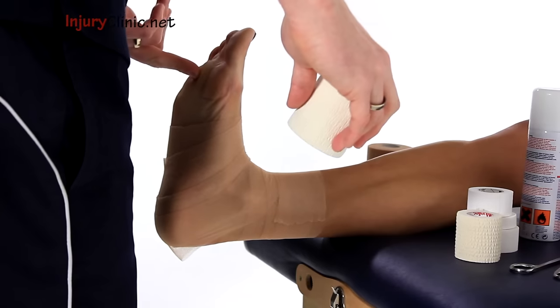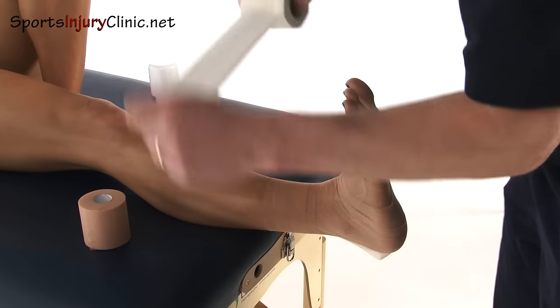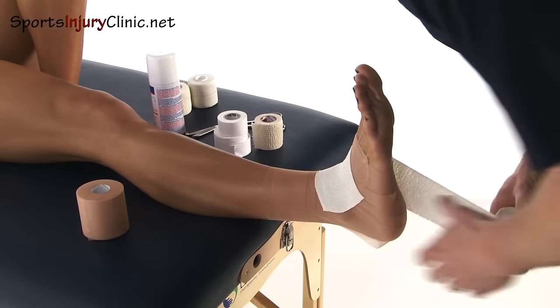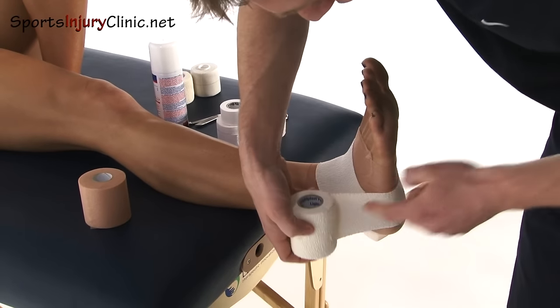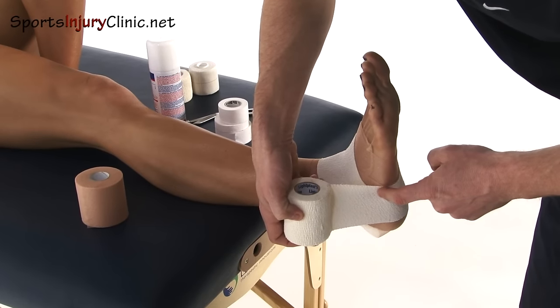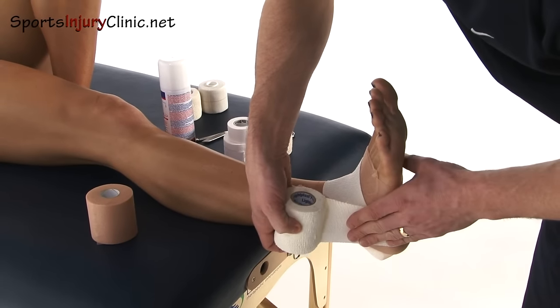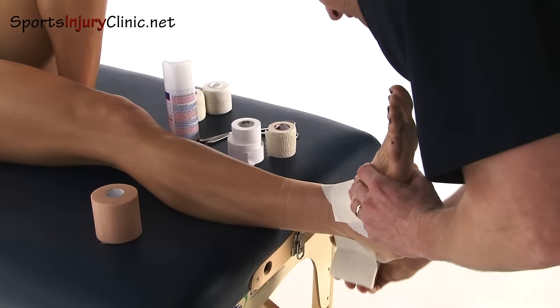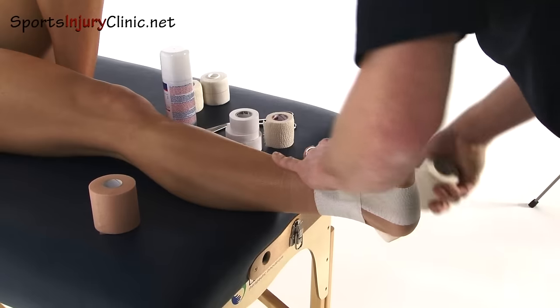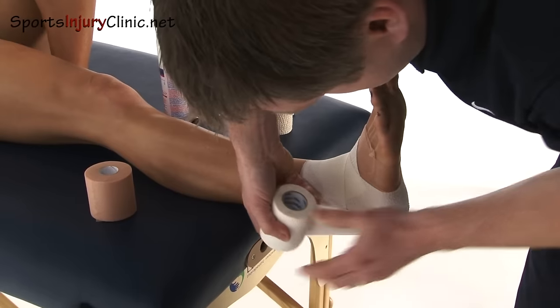I'm going to get the patient to pull their ankle upwards. I'm going to start on the outside of the ankle and then come across to the inside. Be careful here — if you pull too tight at the base of the bony part, they'll find it far too uncomfortable and they'll end up taking the strapping off. So don't pull too tight there. I'm coming across the ankle and making a figure of eight, going round the back of the Achilles.